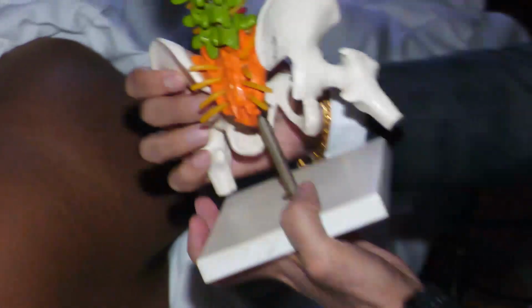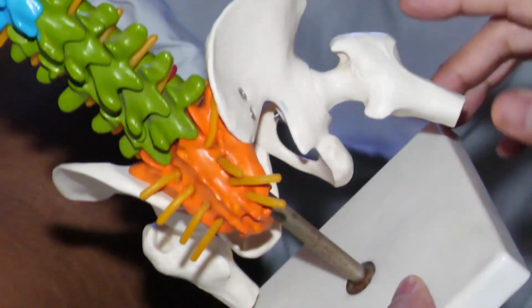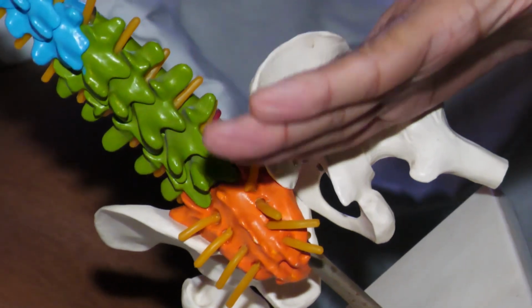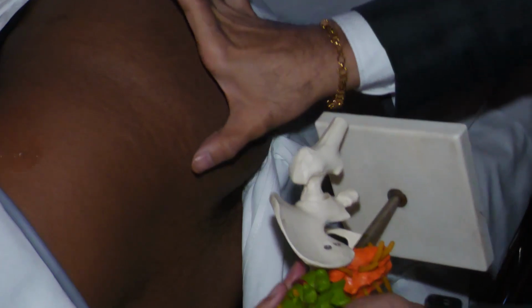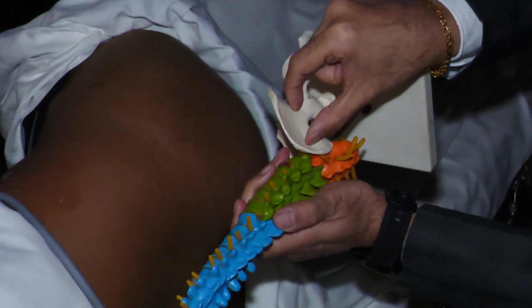Okay. So right now this is the posterior superior iliac spine. This is the greater trochanter, my dear friends. I am drawing a line like this from PSIS to GT. Okay, my dear friends. Next, I'll bisect this line and keep my probe on this bone.